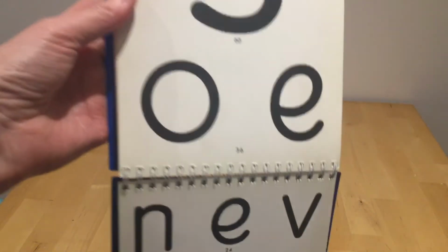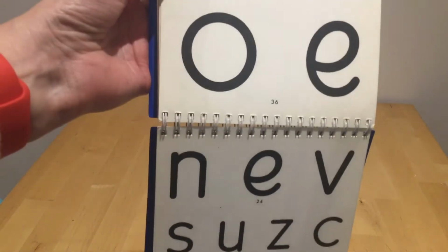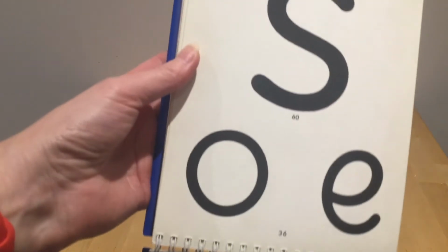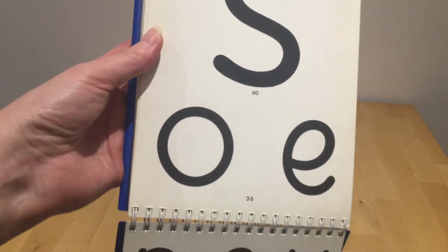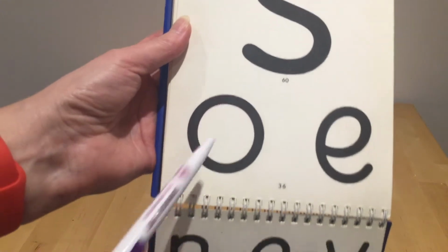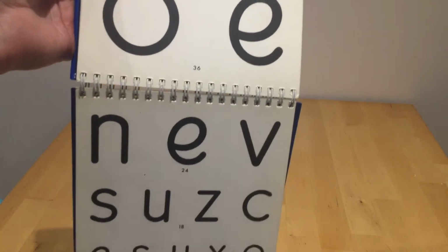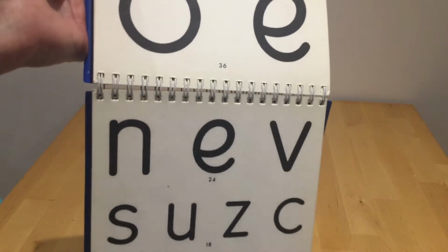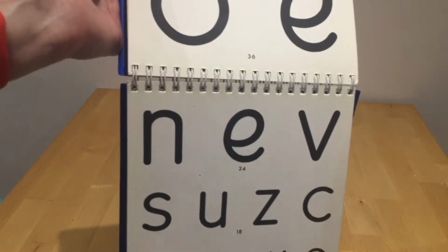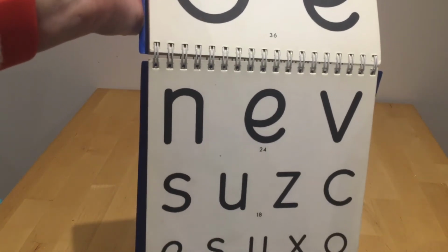So you would hold the test up like this from your chosen distance, 6 meters or 3 meters. And you're going to ask the child or young person to read from the top letter down. When they are doing the test, please do not point to the letters like this. Just hold the test up and let the child or the young person read. You're not there to help them. You want to see how smoothly their eyes are going to move from line to line. It is also interesting to know if they miss any lines.